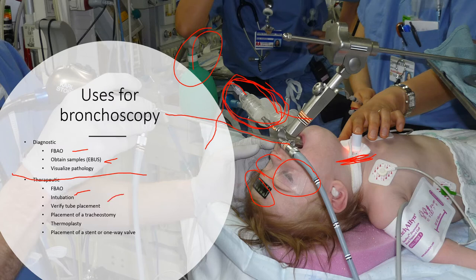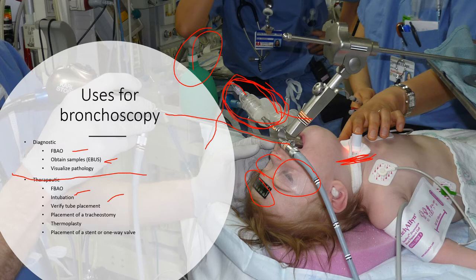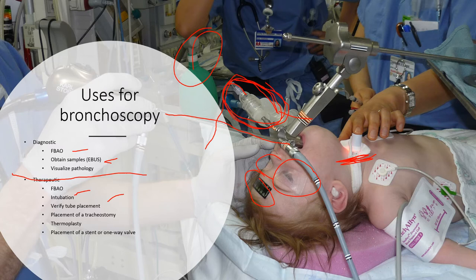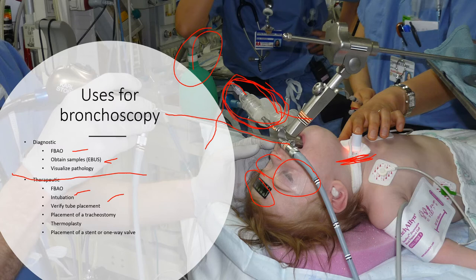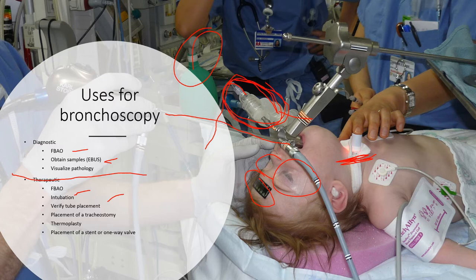You can also use the bronchoscope to verify tube placement. We had a child come in who was intubated in the field, and we didn't know if the ET tube was in the right place because they were doing compressions — very hard to get CO2 monitored since CO2 is a sign of perfusion. We had the anesthesiologist put one of the disposable bronchoscopes into the ET tube to verify we were actually tracheally intubated.